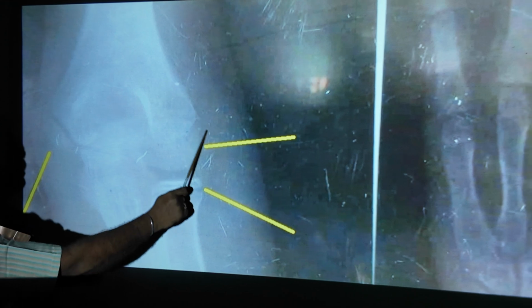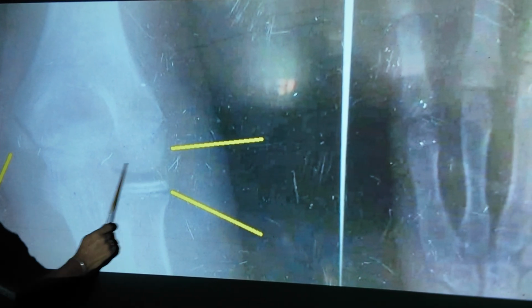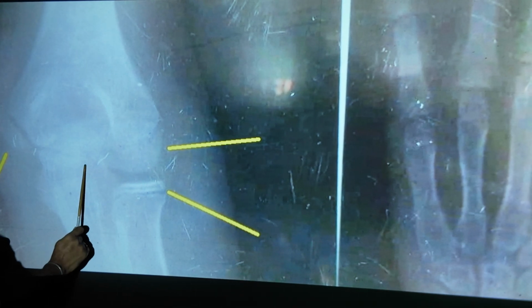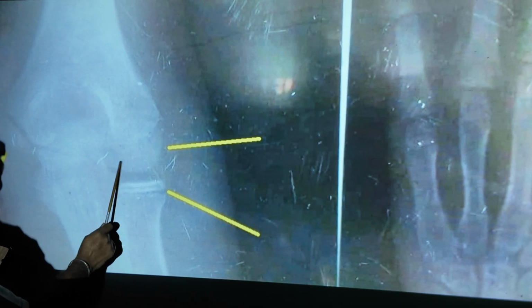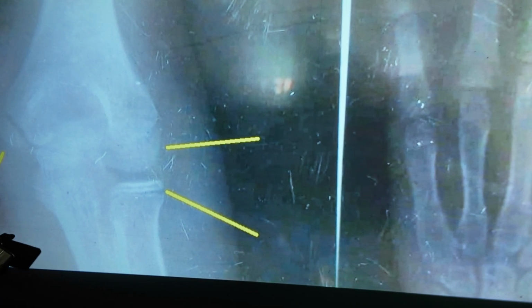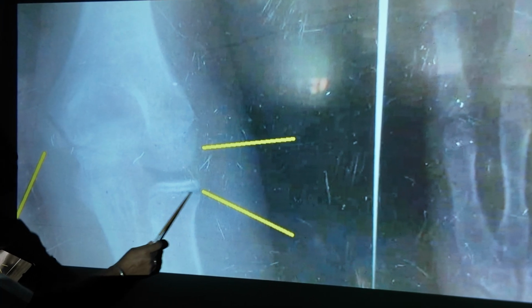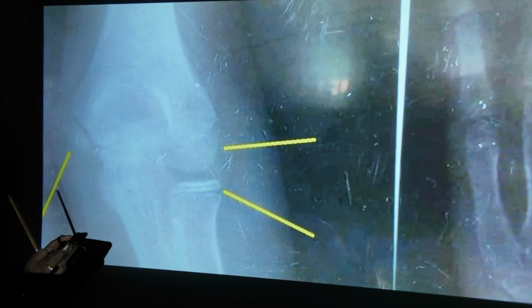Conjoint epiphysis is formed by lateral epicondyle, capitulum, trochlea. These three fuse by 12 years, forming the conjoint epiphysis. Conjoint epiphysis unites with the shaft by 14 years, 14 to 16 years. Upper end of the radius appeared but not fused. This will fuse by 16 to 17 years. Olecranon process not much visible here.